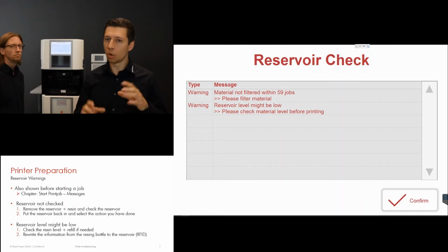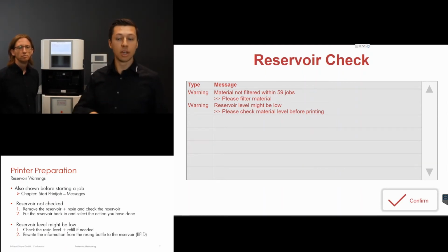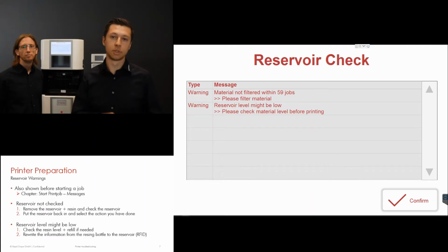So we got the reservoir level might be low. This is all about the resin level, and we then have to check if the resin level is high enough and refill it if needed. Important, the machine is not measuring the height of the material.